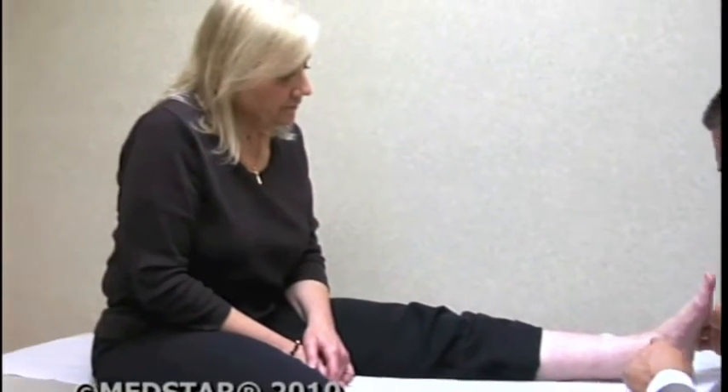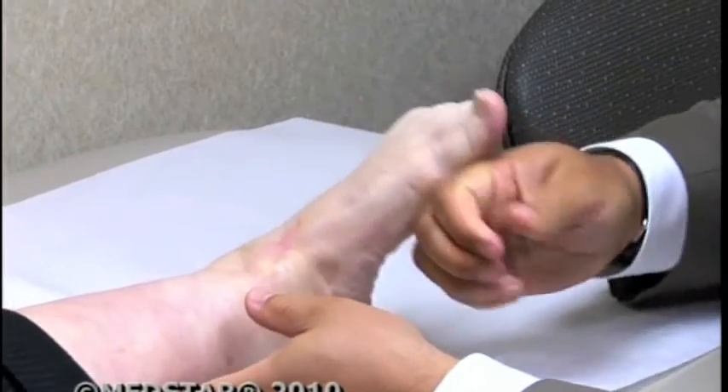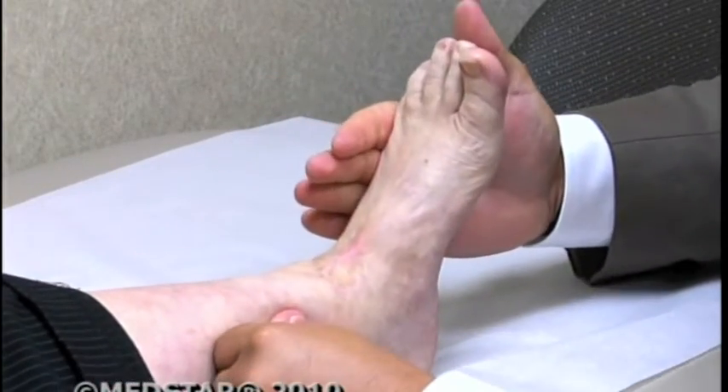The in-bone design not only provides stability, it helps restore the ankle's natural movement. No pain with any of that? None. We typically just think the ankle traditionally goes up and down, but it does a lot more — it has the ability to swivel and pivot.